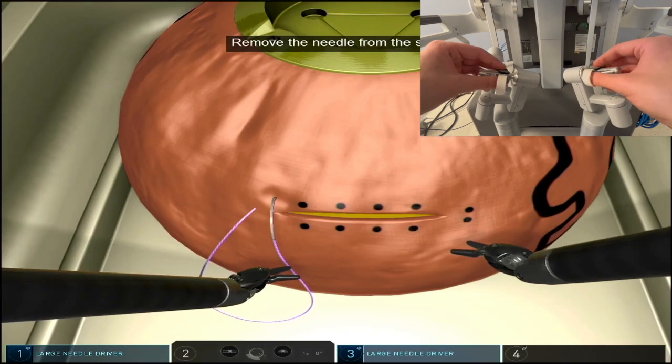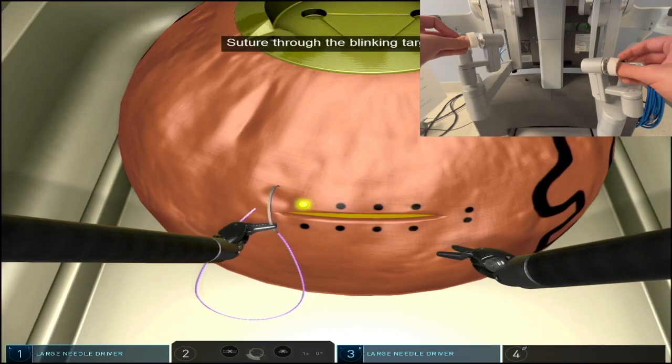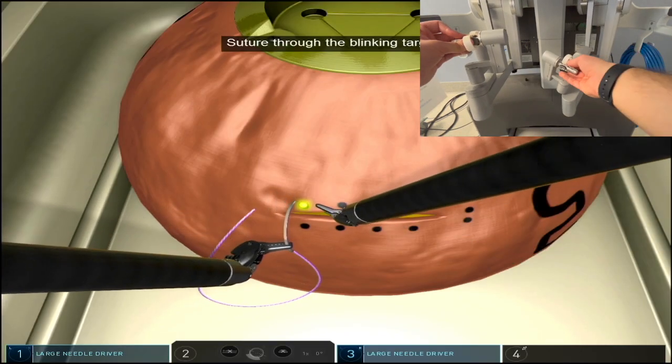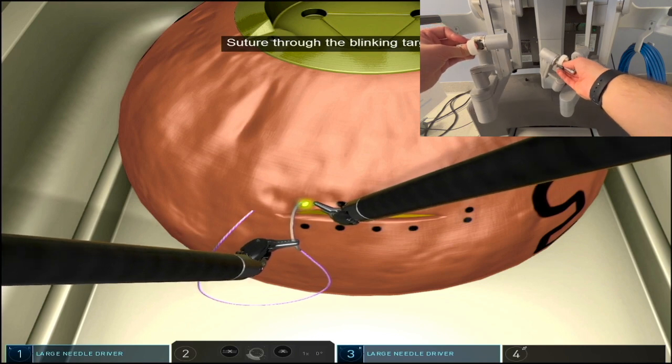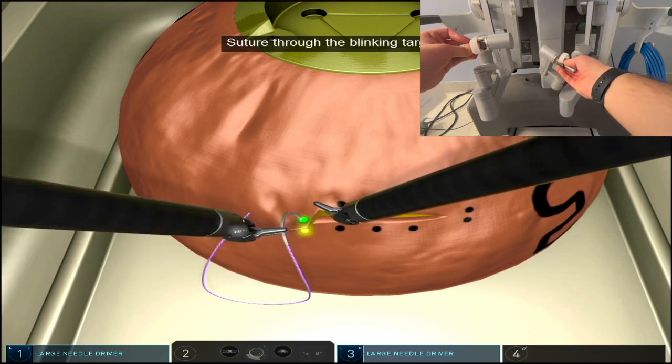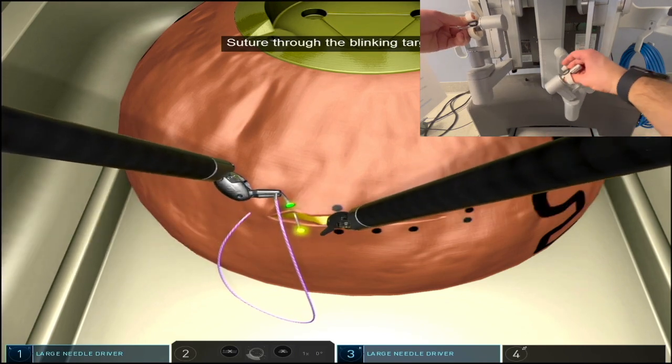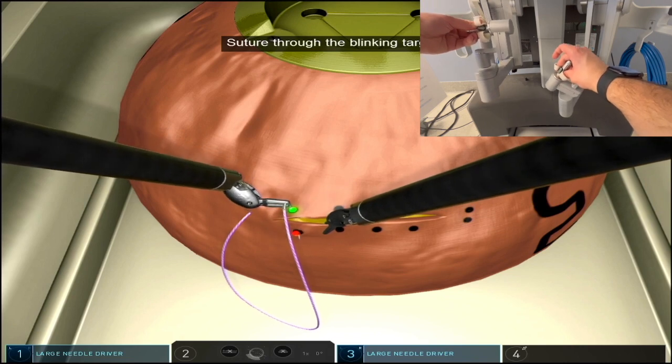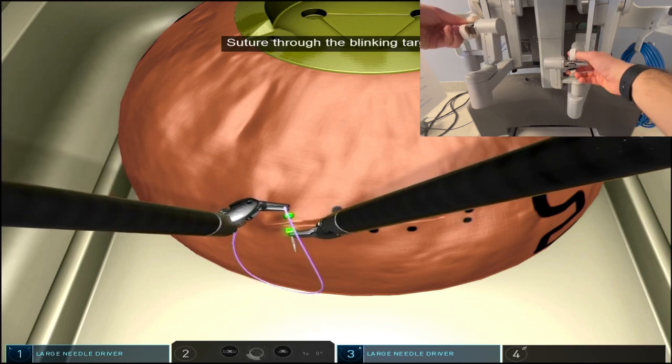There are two types of bites: the ones that you're taking in backhand and the ones that you're taking in forehand. You can take both of these bites in one go or you can do them separately, whichever one is easier.